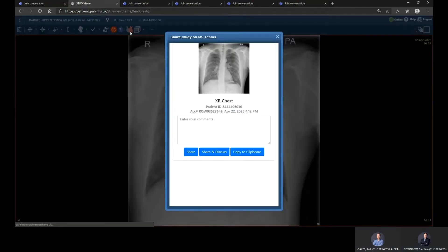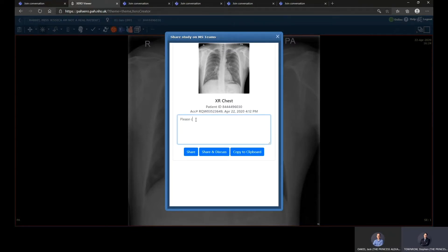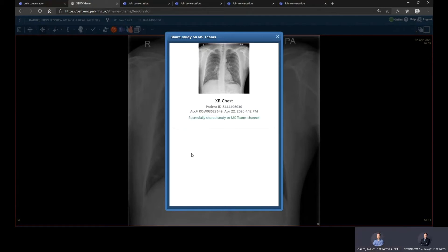I'm going to click on the share button. First of all, you'll see a little preview of the chest X-ray. I've then got a little box where I can type a message, such as 'Please can you review this?' I've then got three options at the bottom: share, share and discuss, and copy to clipboard. Share will send it directly to the vascular team. Share and discuss will send it to the team and also boot up Teams so I can go in and chat. Copy to clipboard lets me copy the link to Xero and send it via another chat medium or email. I'm going to hit that share button — it's successfully gone, with a little message at the bottom confirming it.